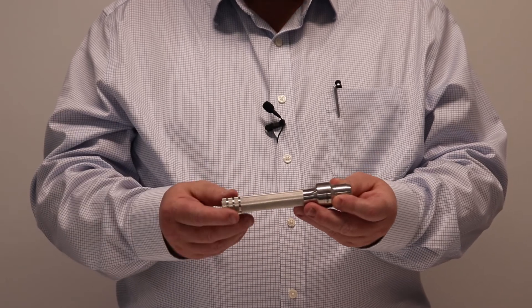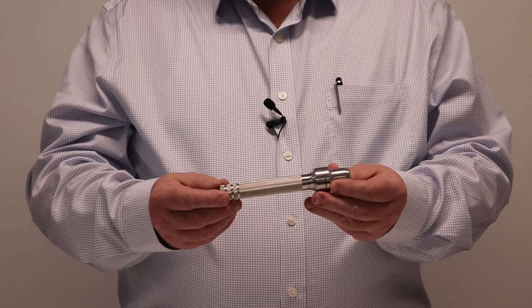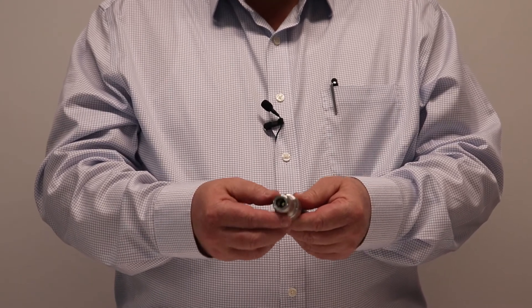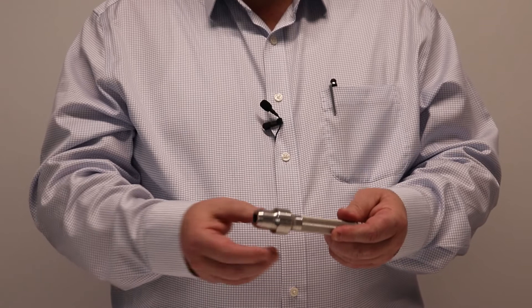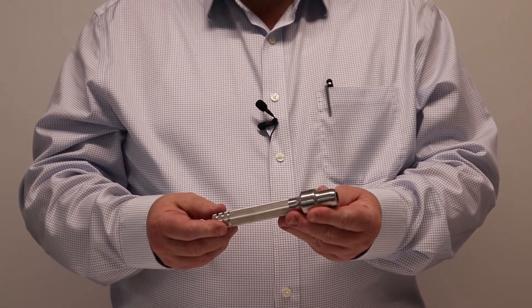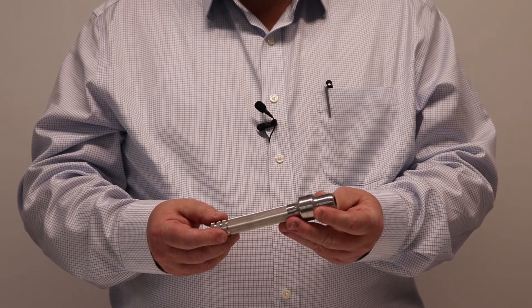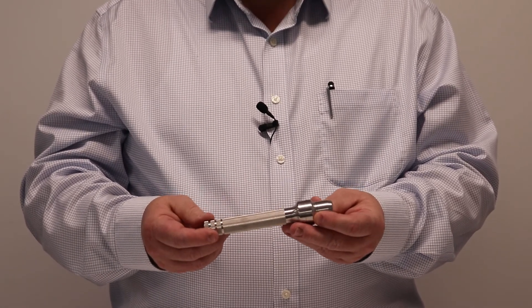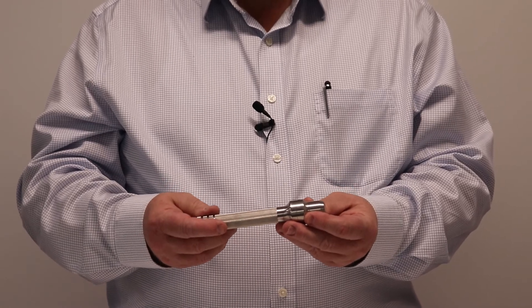It has two AA batteries and a single LED light chip. This activates and switches on when it is connected into the proctoscope. The output is very bright white light, and the level of illumination is excellent for diagnostic work.